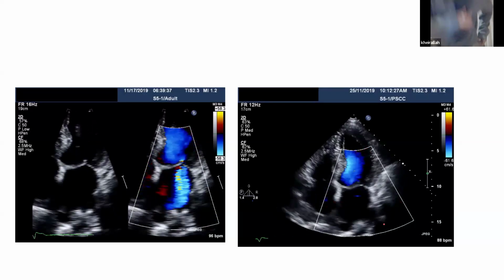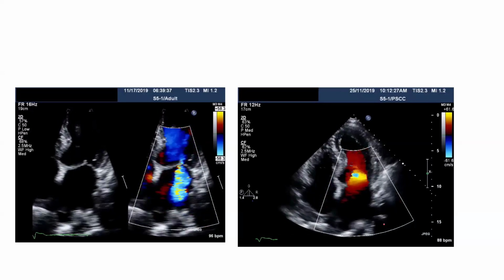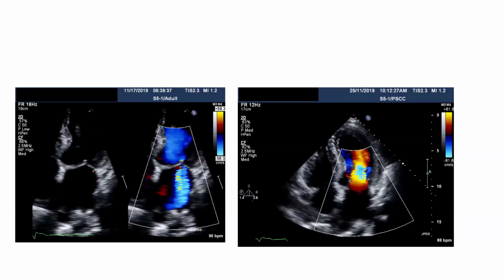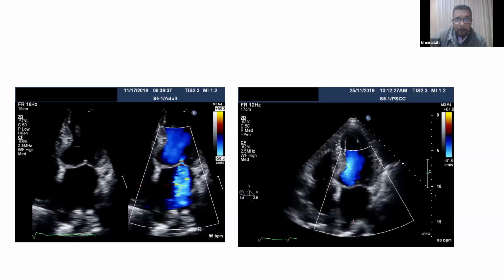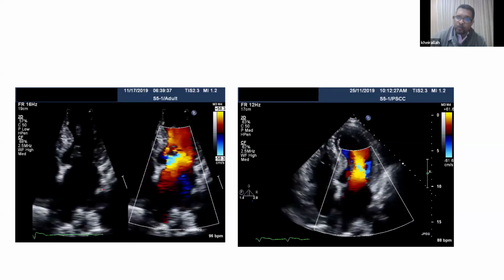Did you say anything? Possibly underwent mitral clip. Mitral clip, yes, possible. Like there was no mitral clip. The mitral valve device, as well. Any device in the interatrial septum? No. No.